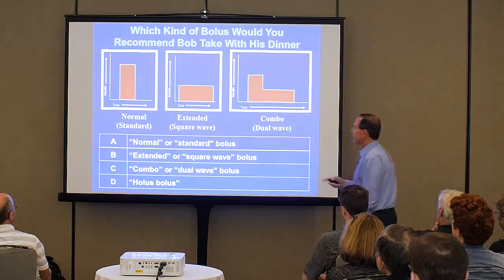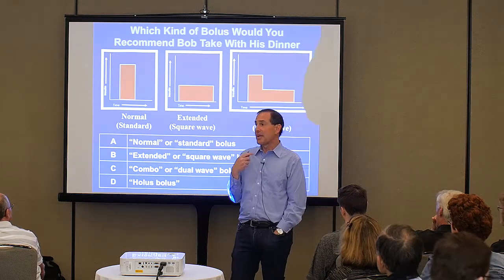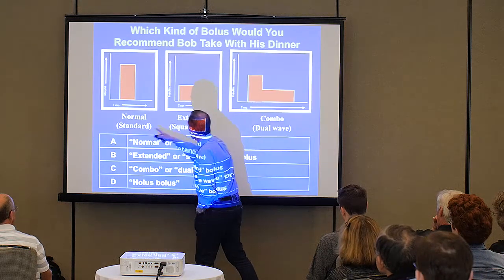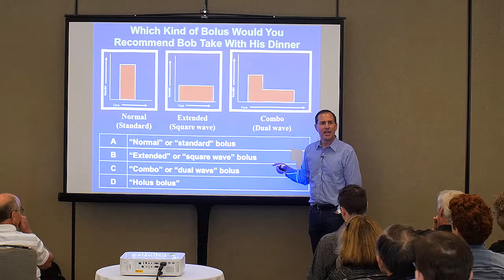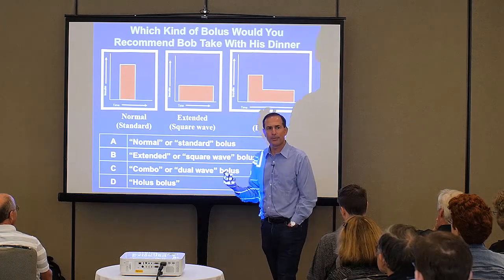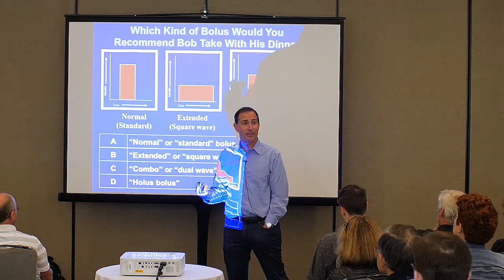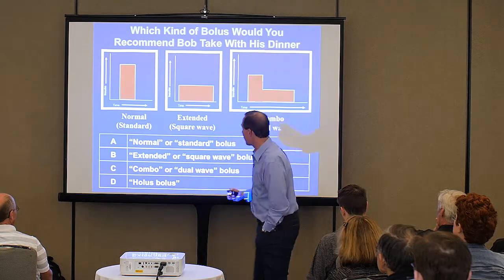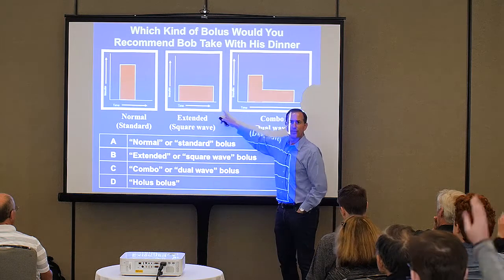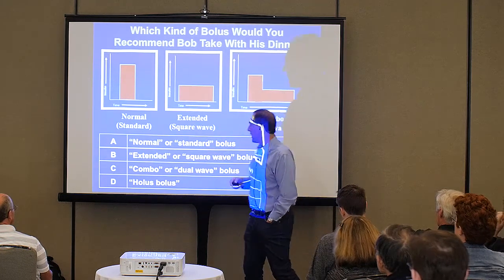So there's three different types of boluses on a pump. Now I can tell you, in my experience, 99% of people use this, 1% of people use that. You're a different audience. I don't want to sound stupid about it, but you're a very special audience. You're here today and you're incredibly knowledgeable, really. I bet you're more knowledgeable than most doctors I've ever met in my life. So how many of you use one of these? Put up your hands if you use either. Yeah, so about a third use that.